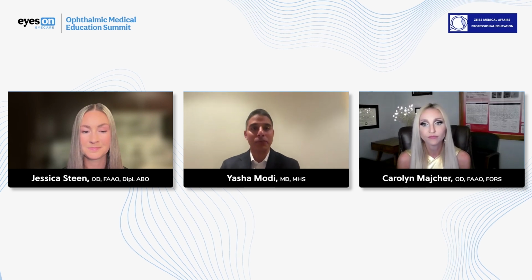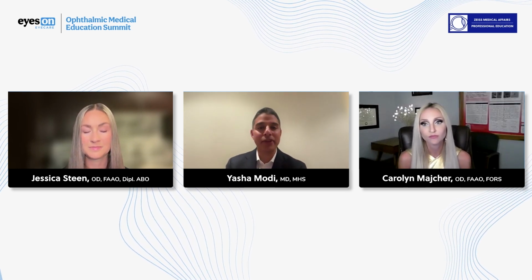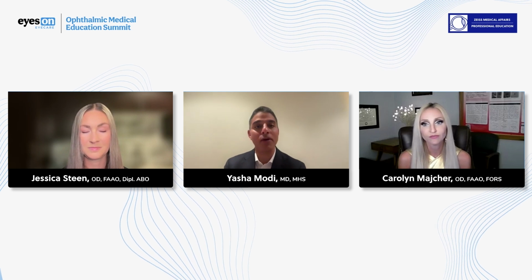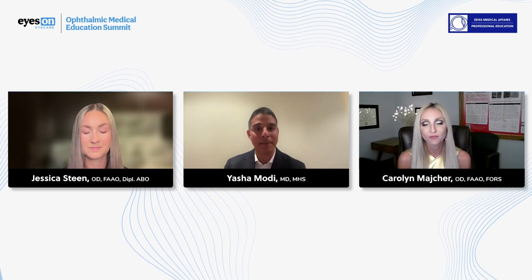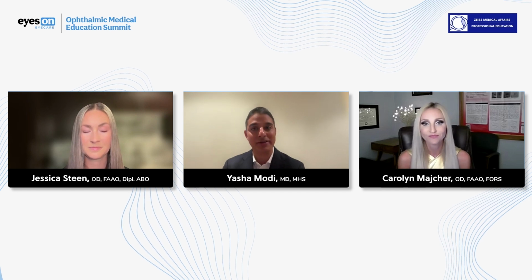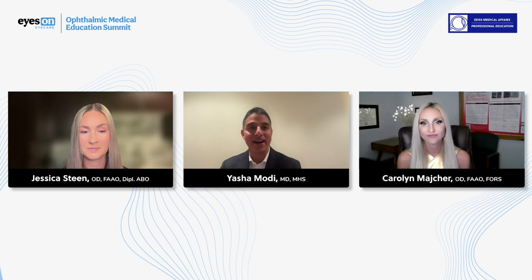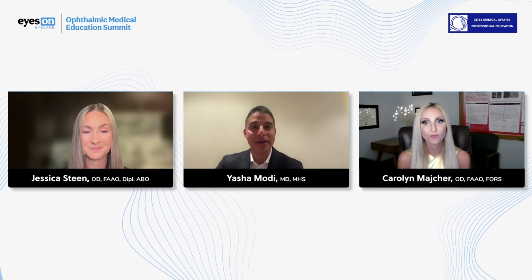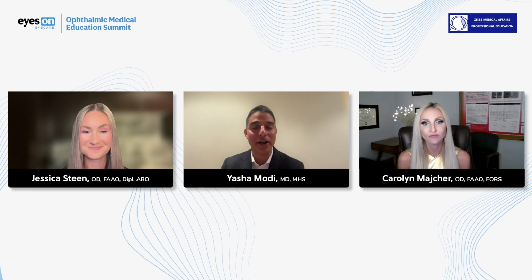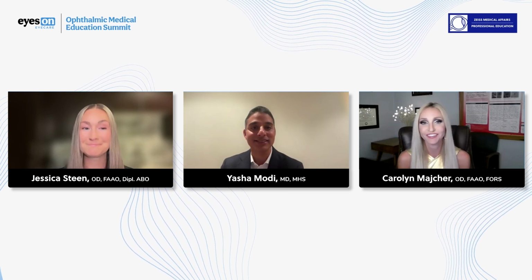Gotcha. And in my talk, I talked a little bit about how in the chronic stages of RVO versus RAO, we have this really thin inner retina, but it's hard to know the differentiating features. And that alludes to the polling question. I imagine, Dr. Steen, Dr. Majcher, have you ever looked at a patient and wondered whether it was an RAO versus an RVO in the chronic stages? Most certainly.